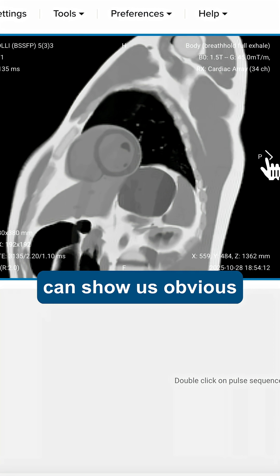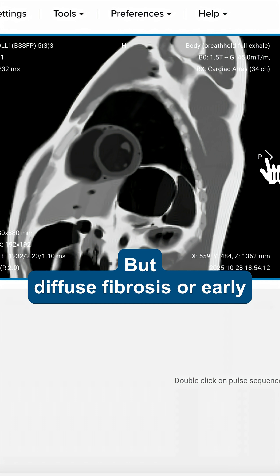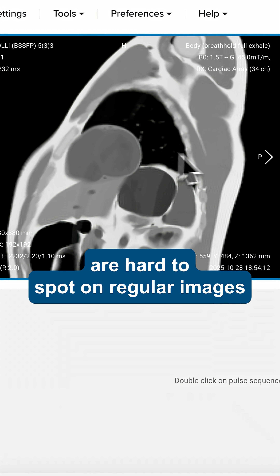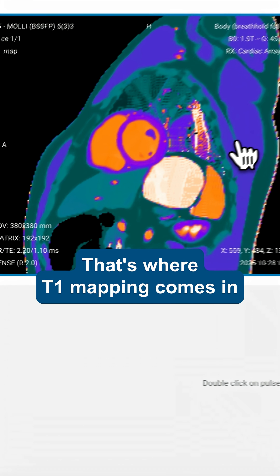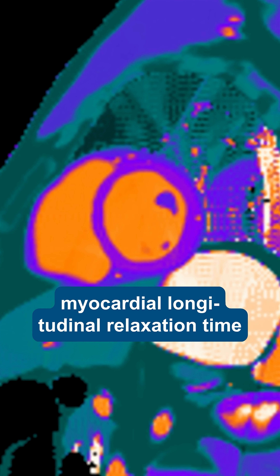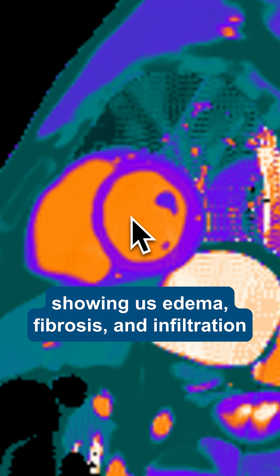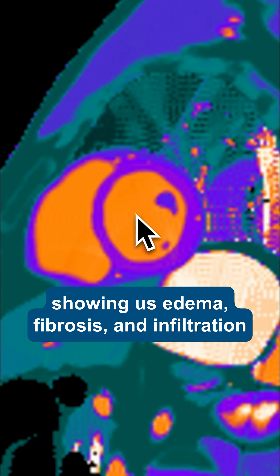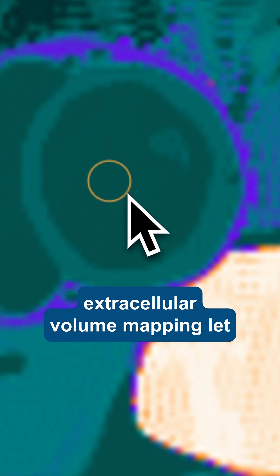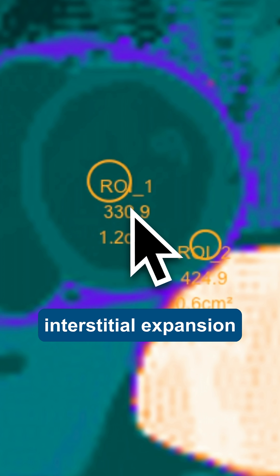Cardiac MRI sequences can show us obvious scars and damage, but diffuse fibrosis or early infiltration that hasn't yet changed the structure are hard to spot on regular images. That's where T1 mapping comes in. Native T1 mapping lets us measure myocardial longitudinal relaxation time with pixel-level accuracy, showing us edema, fibrosis, and infiltration. Post-contrast T1 and extracellular volume mapping let us quantify the extent of diffuse fibrosis and interstitial expansion.